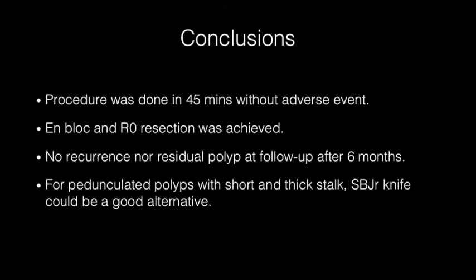The procedure was completed in 45 minutes without adverse events. En-bloc and R0 resection was achieved. No recurrence and no residual polyp at follow-up after six months. For pedunculated polyps with a short and thick stalk, the SP-Junior scissor knife could be a good alternative.